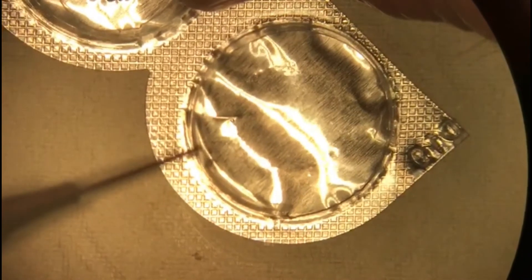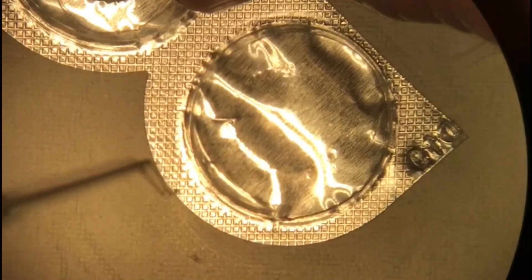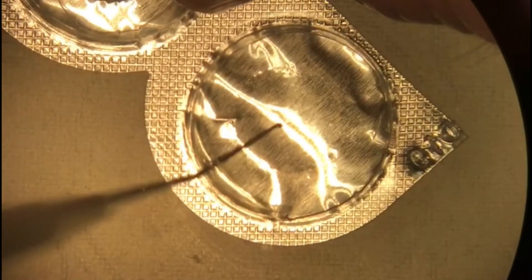This section demonstrates the technique for second instrument entry and exit via a small incision in the side of the plastic lozenge packet.